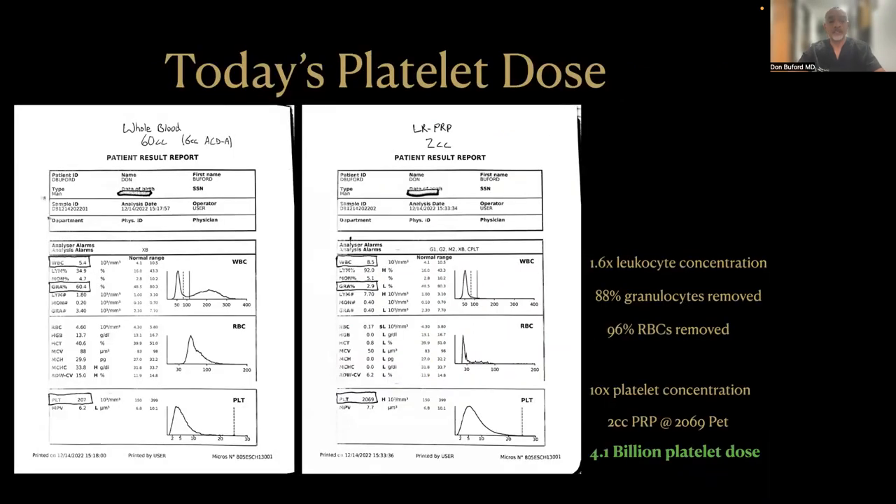This is the hematology analysis on the PRP that was done today. You can see we started on the left with a white blood cell count of 5.4. The granulocyte percentage was 60.4, and the platelet count was 207, all within normal range. After making the PRP, which was a 2 cc volume, the WBC count was 8.5, which is a 1.6 times increase in the leukocyte concentration, so it meets the criteria of being leukocyte-rich, although it's not extremely leukocyte-rich. The granulocyte percentage dropped to 2.9%.